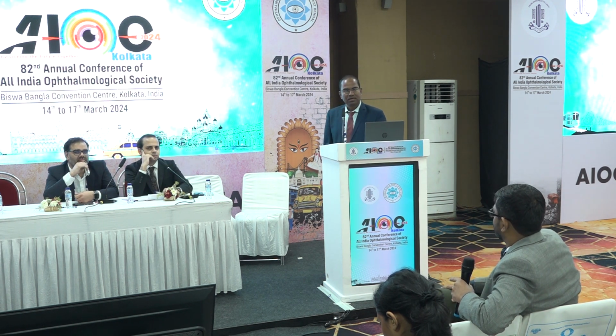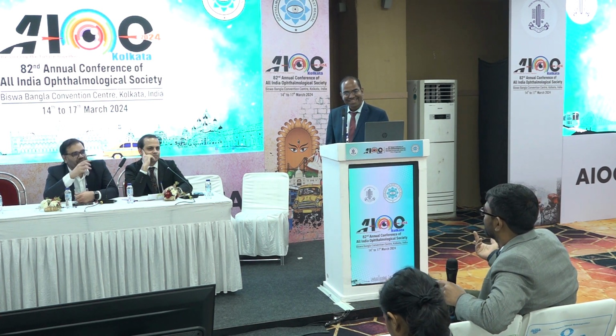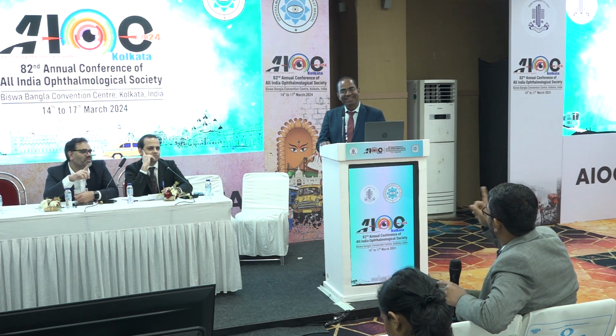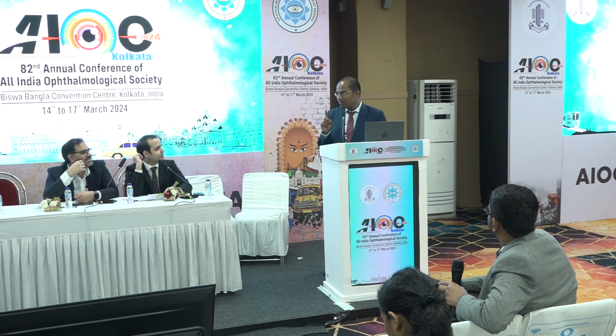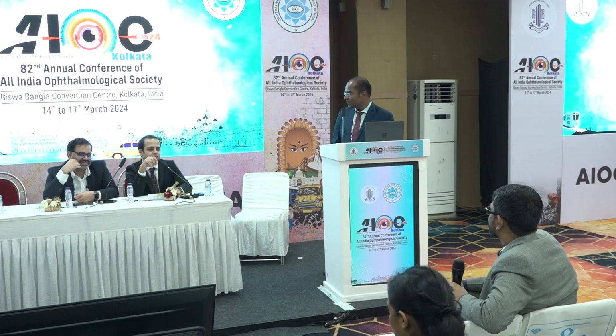Somehow I feel the most difficult PVDs have always been in dropped nucleus cases. I don't know why. I have had deep-set eyes and hard cataracts, and sometimes spent half an hour just trying, and there is still no PVD. These eyes have often been sent to us with the IOL. Why it happens, I don't know. But the question is, do you really need to induce a PVD in these cases?